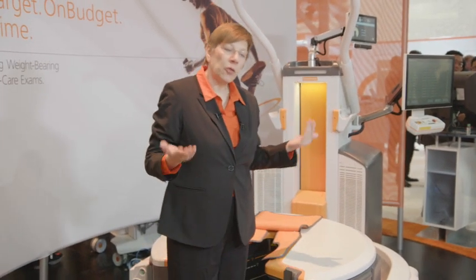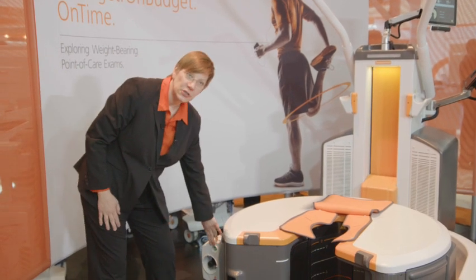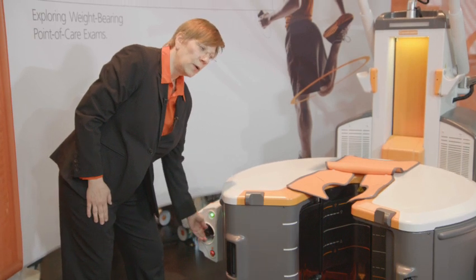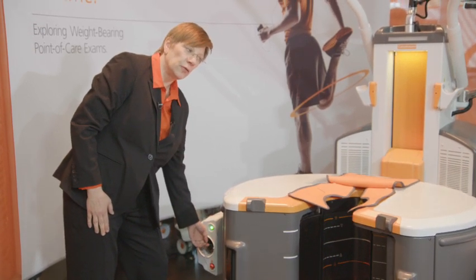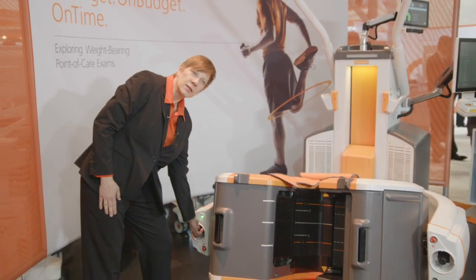We can move the system in three axes. We have two control panels that will allow us to do that. We can move the system vertically, and we also have the ability to angle the board this way, as well as this way.